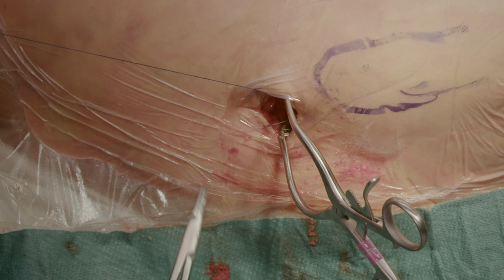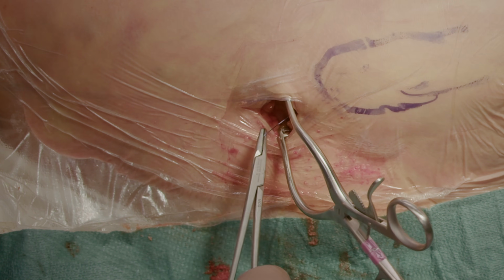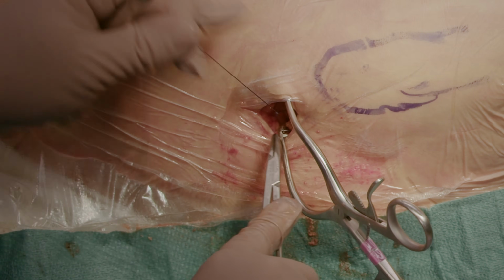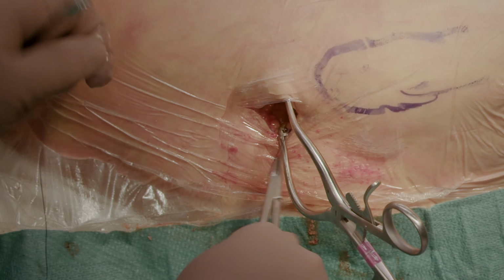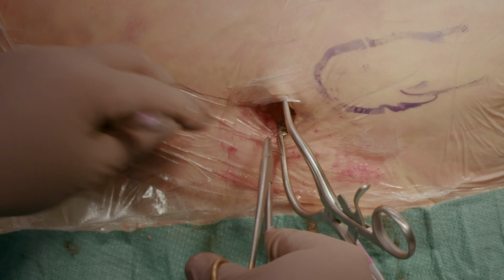It is possible to place an end cap on the proximal end of the nail to prevent bone ingrowth. In young patients, the nail may need to be removed in the future, so placing the end cap should be considered. But in elderly patients treated for hip fractures, placing the end cap is not necessary.